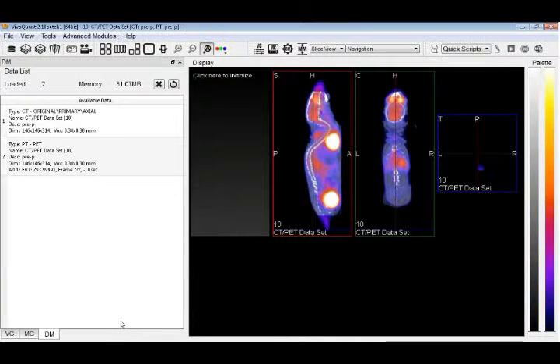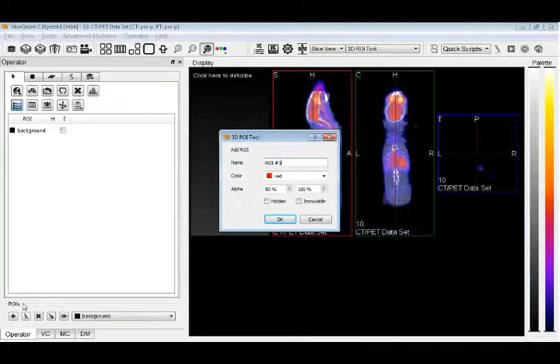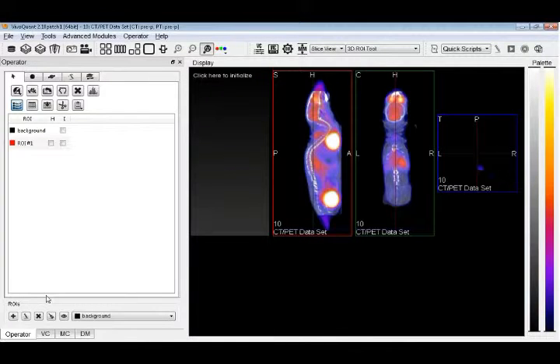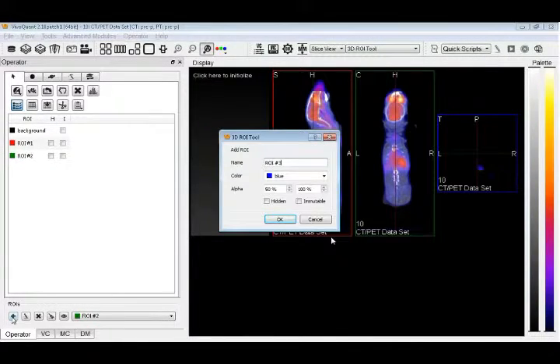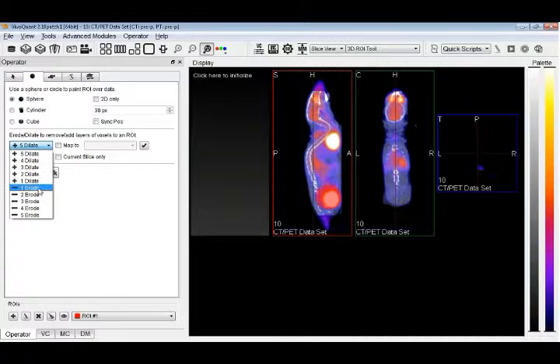Right. Okay. All right. So first, I'm not actually going to draw a tumor ROI. I'm just going to draw a sphere. And I'm going to erode it twice so that you can see how you would go about creating an onion on your own. So I'm going to make it really big so that you can see what's happening. Put it there. And so now we have the erosion dilation tool, which was mentioned earlier. And let's see, this is pretty big, so maybe do the 2.